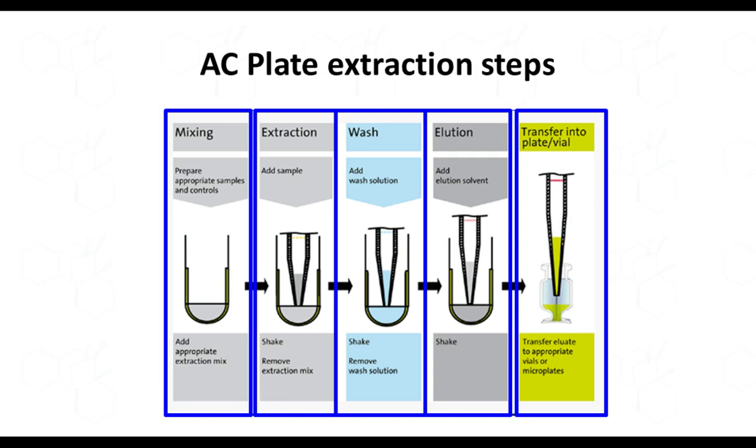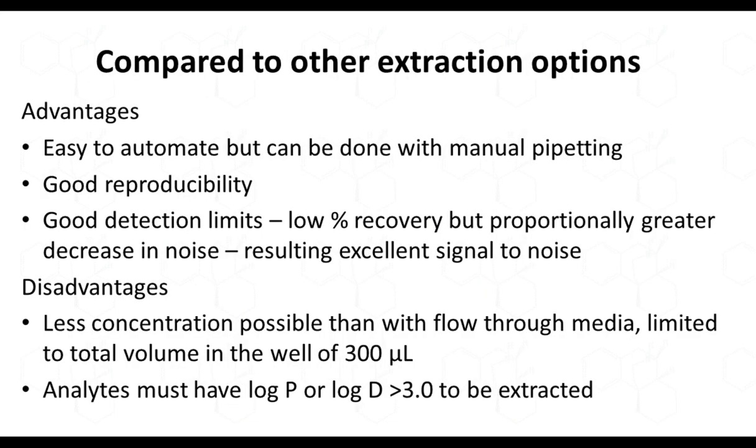And the next step would be to add a wash solution, so that's to remove residual matrix. And again, there's shaking, typically for 5 minutes. Then the tips are used to throw away that waste. And finally, an elution reagent is added. So in some manner, we shifted the conditions, the organic solvent or the pH or both, such that the analyte comes back out of the resin into the liquid phase, again for 5 minutes of shaking. And then finally, TECAN recommends that you transfer that to an injection plate, although you don't have to.